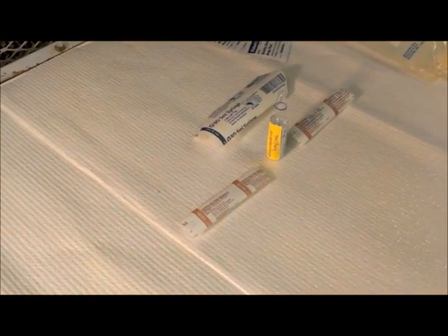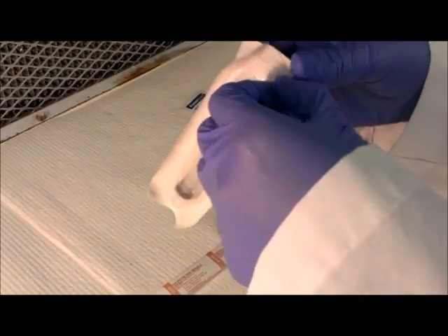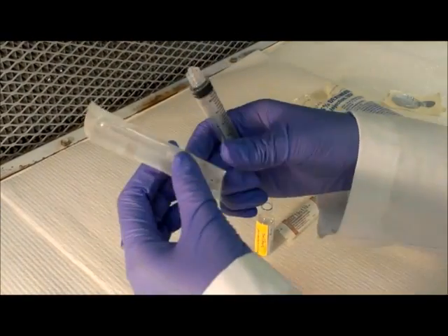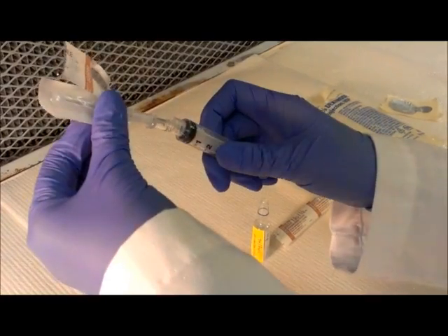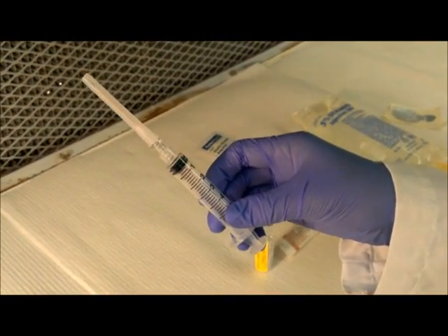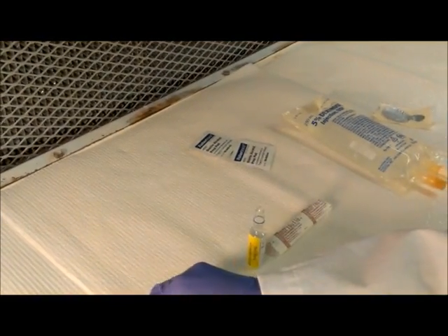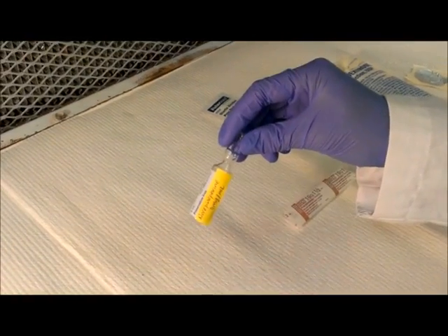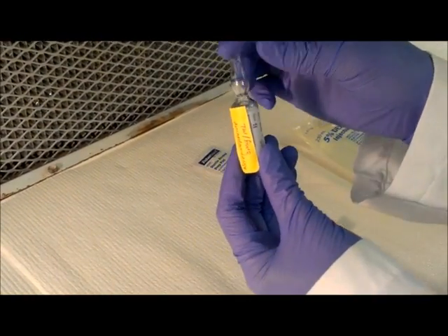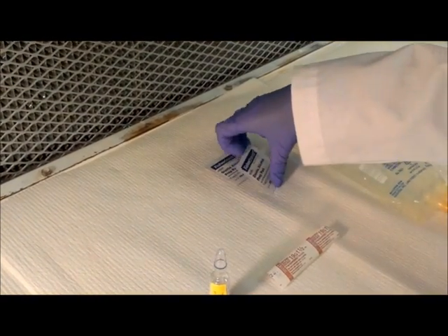Now Christine will assemble the filter needle and syringe. Notice that she puts any garbage to the side of the hood. She will then lay this aside as she prepares the ampule. To prepare the ampule, Christine will tap the top of the ampule to remove any excess liquid that is caught.